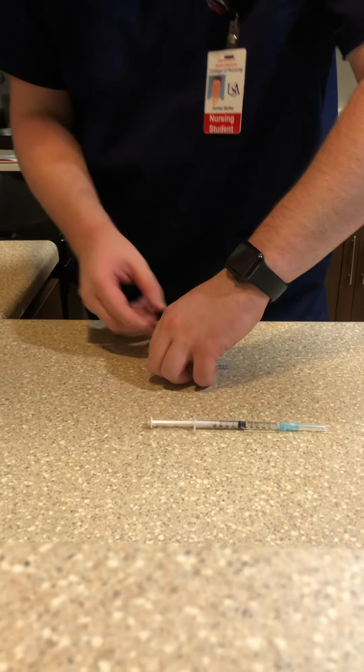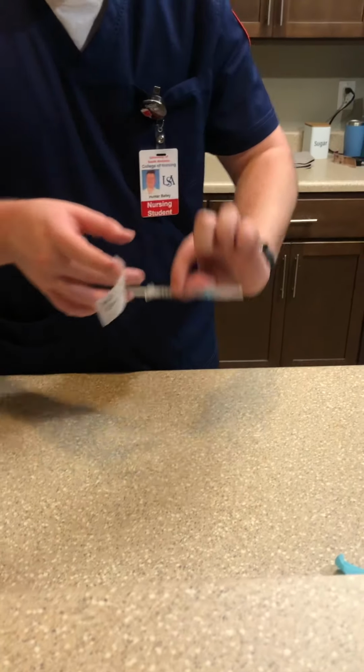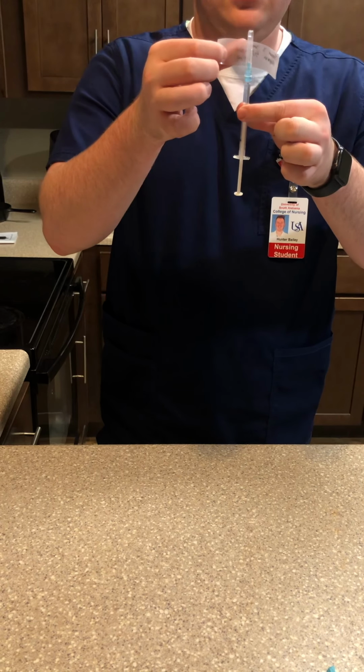Okay, so now I'm going to pick up my syringe. I'm going to place this right here.